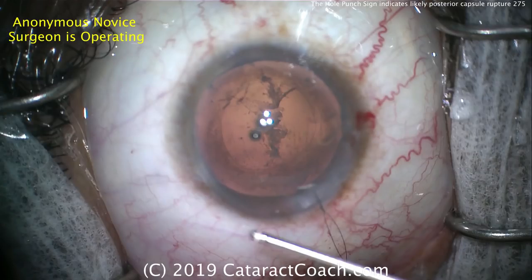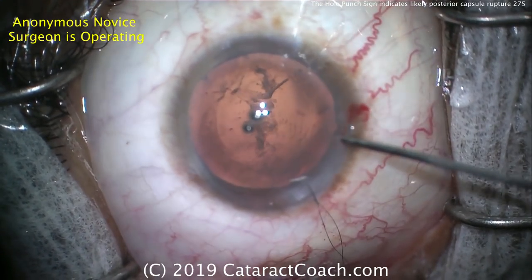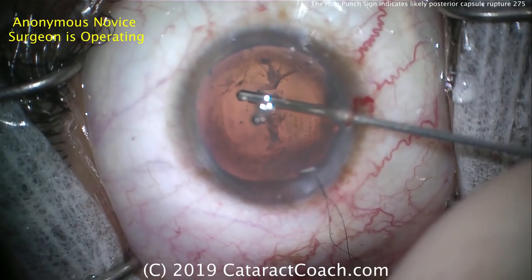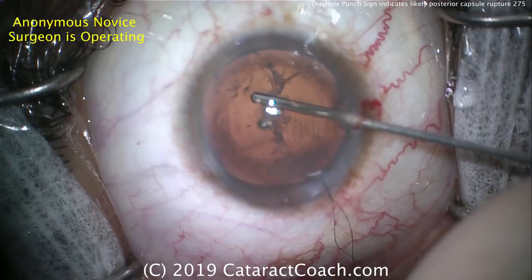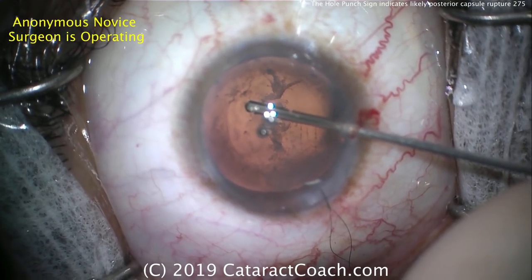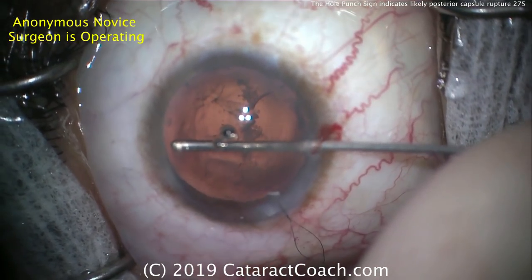There is quite a bit of cortex that still needs to be removed. At the end of the case, the surgeon puts a suture temporarily in the main incision — I like that idea. Now going into the eye with the anterior vitrectomy setup, nice small gauge through the paracentesis. It looks like just using the cutter in one hand — I would also put an infusion in the other. You can do the cutter via the pars plana of course, but it's very reasonable and most surgeons will choose to do it via the limbus.